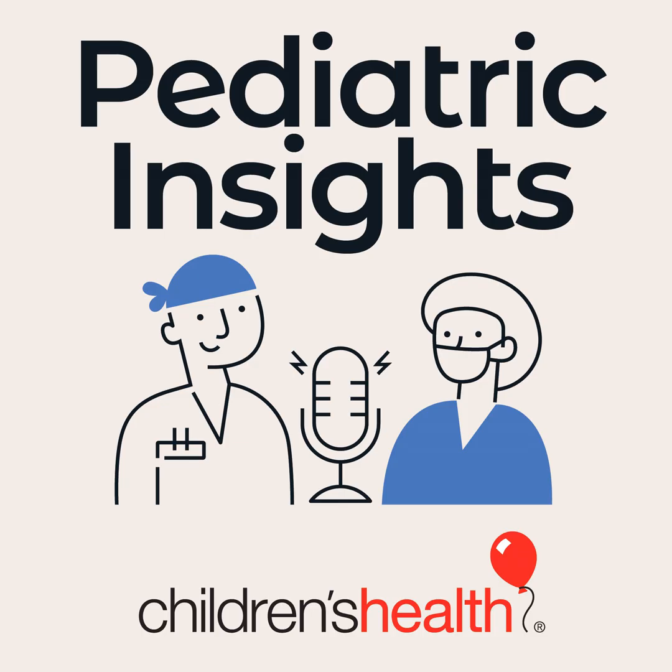And in the United States, a few centers have been able to adopt what they've learned in terms of imaging the fetal heart and being able to acquire these new devices that allow us to obtain the fetal heart rate and extrapolate the fetal ECG. And these are new things that we have now.